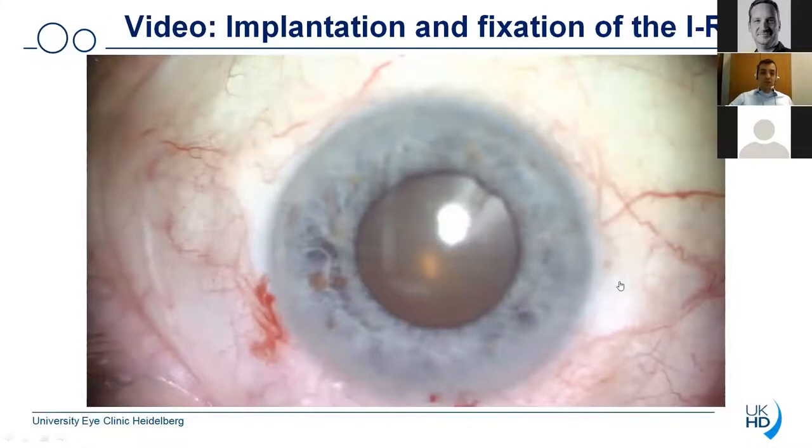So let's have a look at a surgical video where I implant and fixate the eye ring. You already see that this is indeed a case where the pupil is not really very well dilated. You probably all agree with me that once the pupil is in that stage in the beginning of surgery, you could go ahead and do normal surgery, but oftentimes the pupil really gets very small during surgery and you unnecessarily put the patient at risk. So I would always recommend when you are in doubt and not sure if the pupil is very well dilated, rather use a device because you are doing no harm and rather a lot of benefit to your patient.